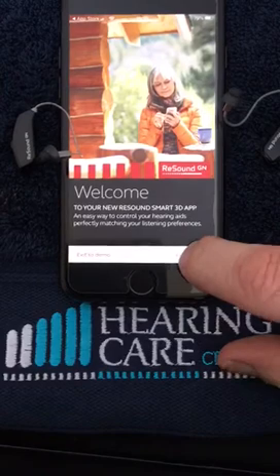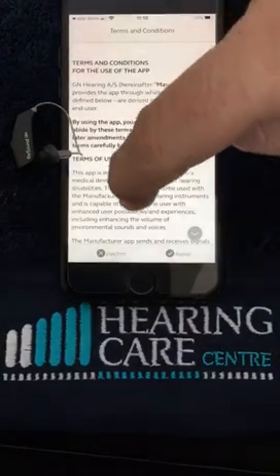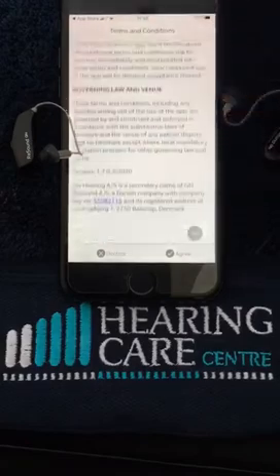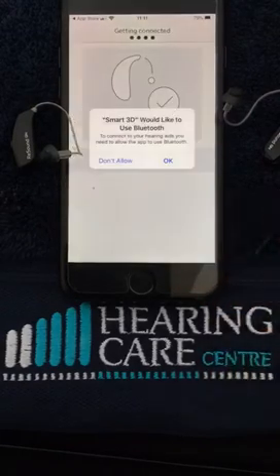We click on Get Started. There are lots of terms and conditions here — by all means read them, there's nothing contractual in there — but you will need to scroll down to the bottom and hit Agree.